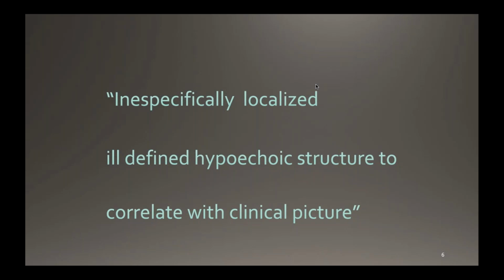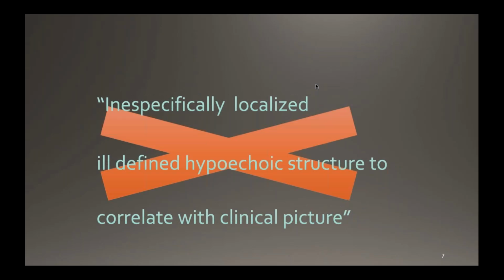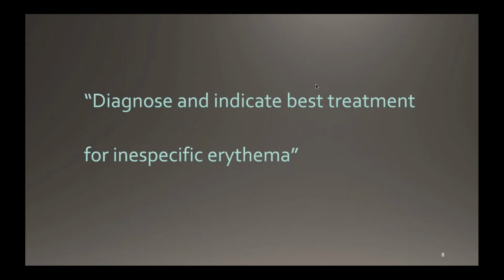That is of no use to us as dermatologists. It says nothing, and it gives no value that I can offer to my patient. If I receive two or three reports like this, I will stop requesting dermatologic ultrasound. I need valuable information that is helpful for me to better treat my patients.